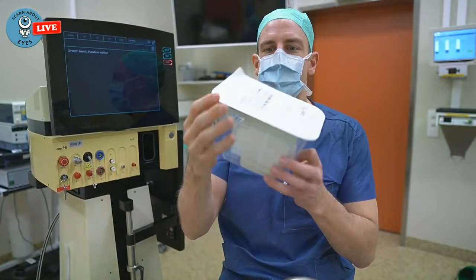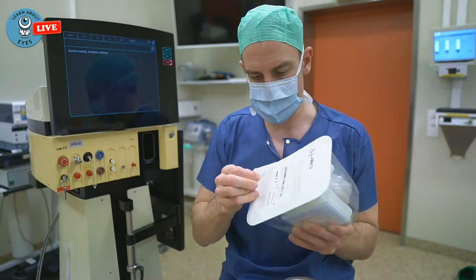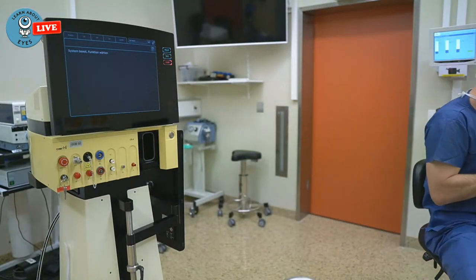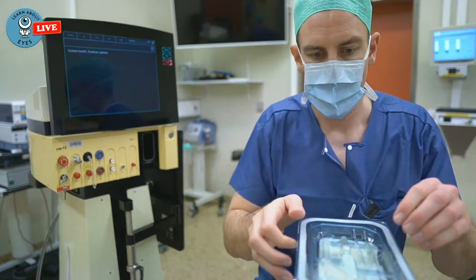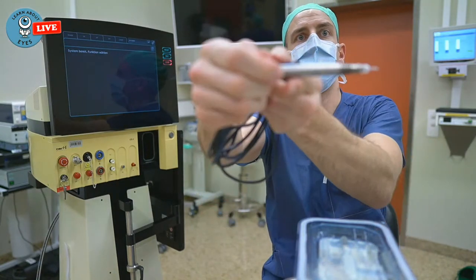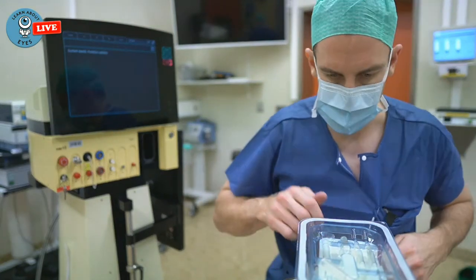All right, so Oertli was actually nice enough. They're a really great company. They are really nice in providing things to practice and to work with. So they did provide these sets. Let me just take that trash closer here. And they did also provide me with a phaco tip that is only for wet labs. I do still have the old phaco tip on there, so I should probably remove that.